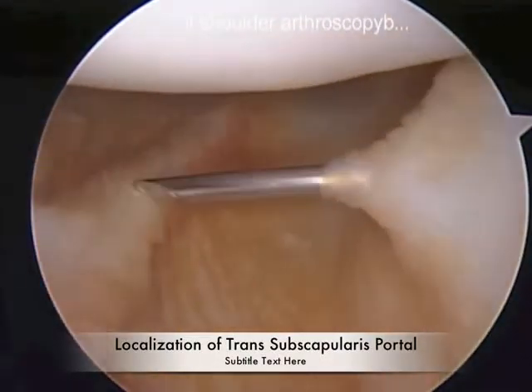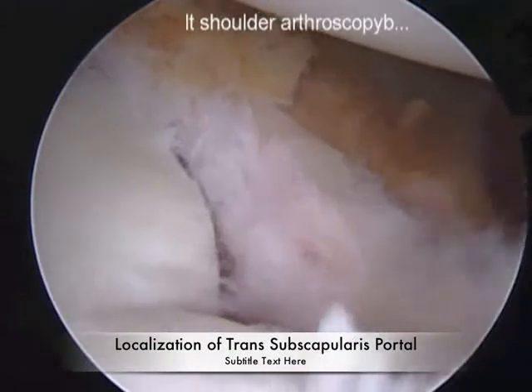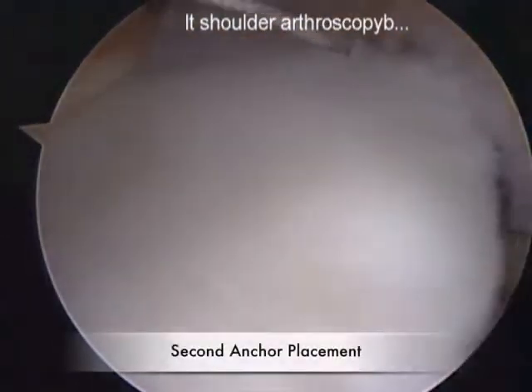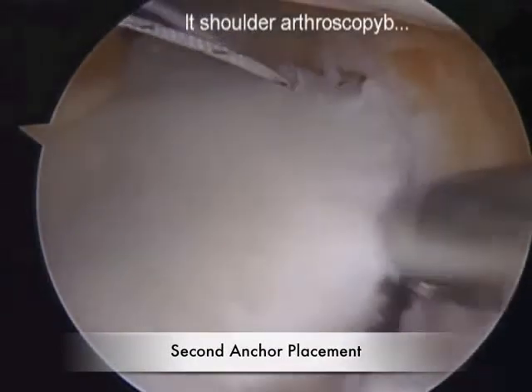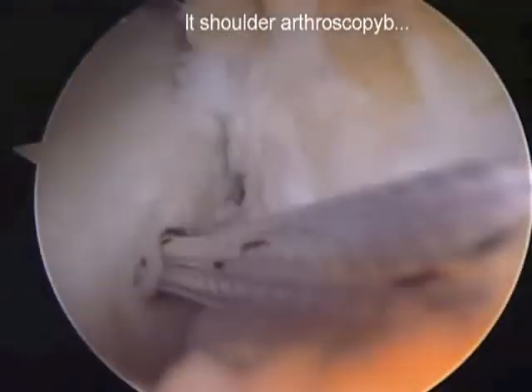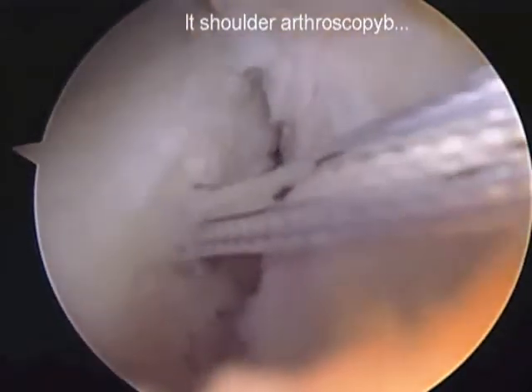A spinal needle is again utilized to localize the trans-subscapularis percutaneous approach for the second anchor placement. The drill guide is placed on the subchondral bone to ensure that the anchor placement will be parallel to the drill holes in the bony fragment.